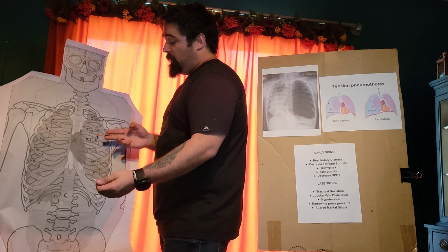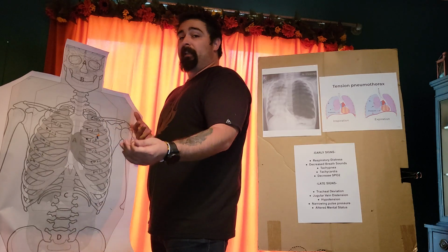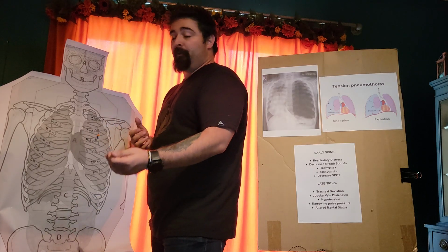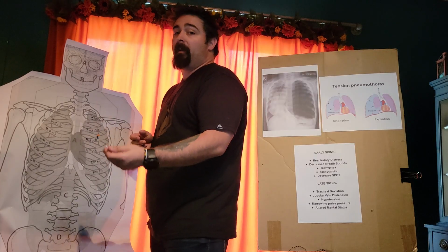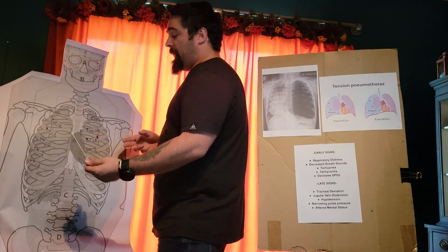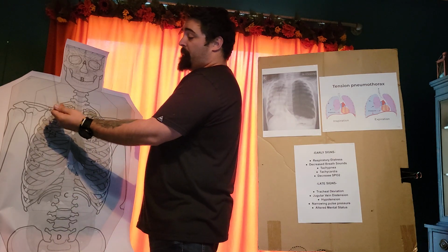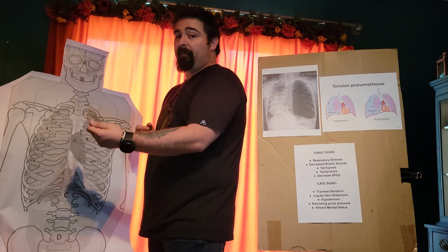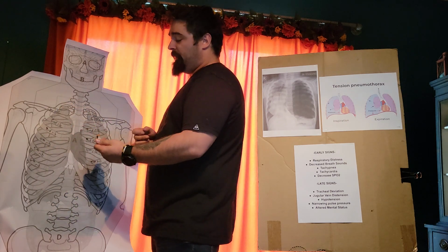So when this is done correctly, typically the patient will have that relief. They'll be able to take a full breath. You're going to see now improvement in their breathing. Their respiratory rate can go down. Their heart rate may typically go down. If you have progressed to the point where you have tracheal deviation and jugular vein distension, now we're looking at that reducing.